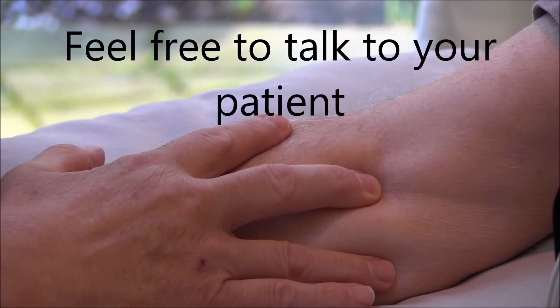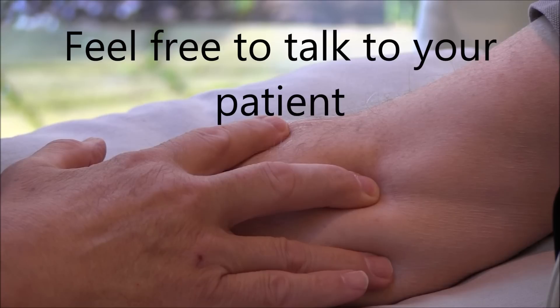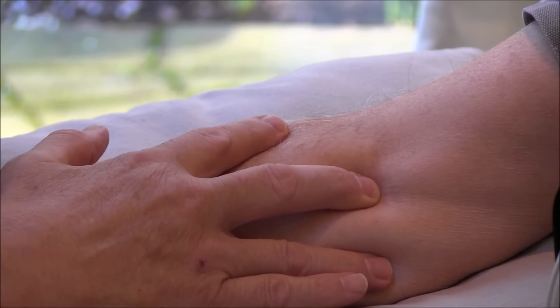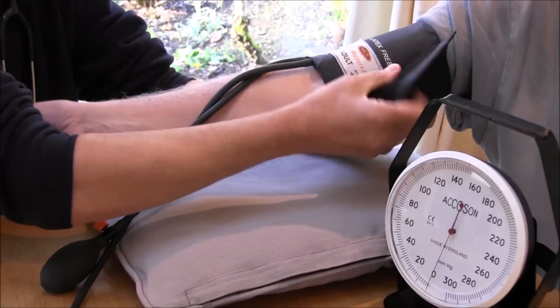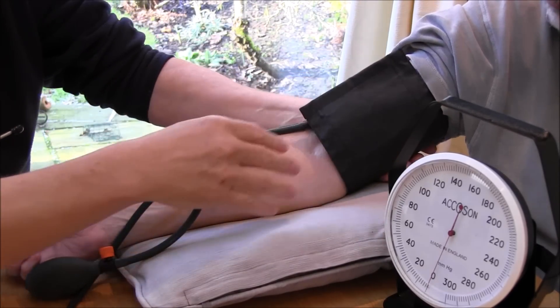I can feel Bill's brachial artery pulsating there. I'm pressing it quite hard. So I can feel the brachial pulse there quite nicely. With a bit of practice you get to know exactly where the brachial artery is — it's very consistent between individuals. I'm just going to put this cuff on now Bill — you've had this done plenty of times. And it's nice and easy with these velcro ones.